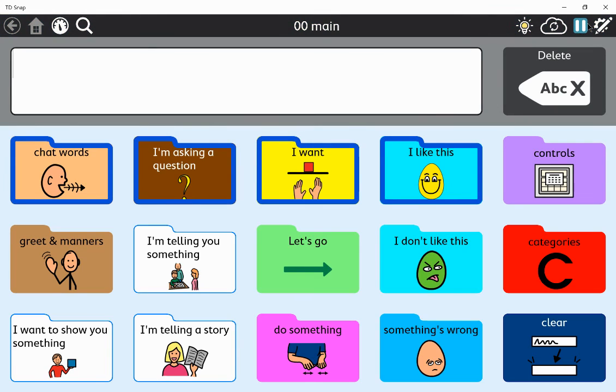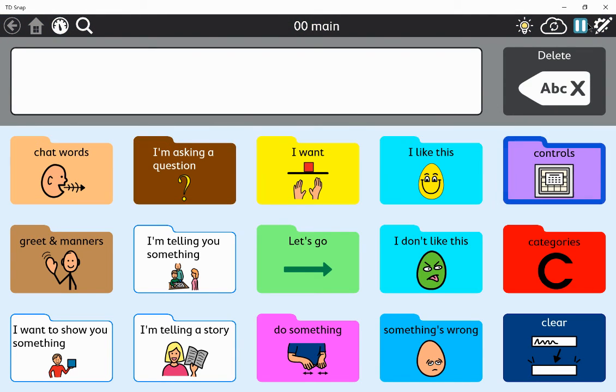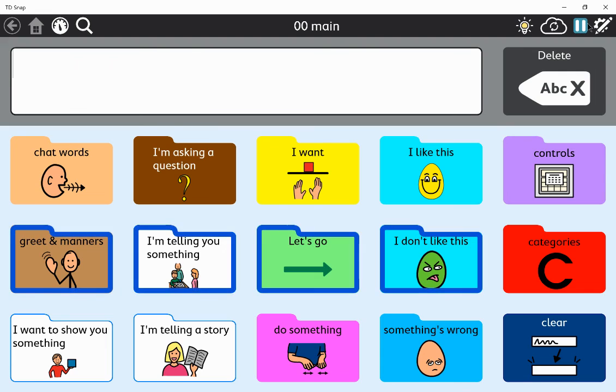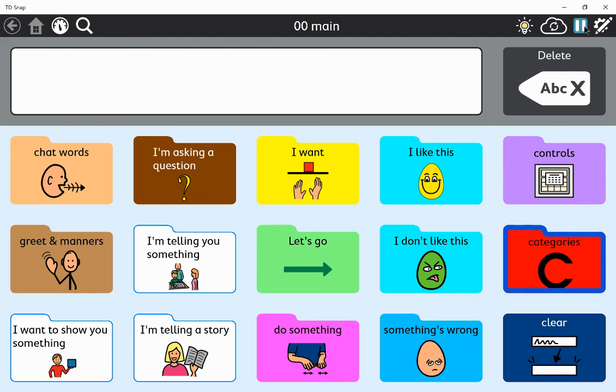Chat words. Question. I want. I like this. Controls. Greet. Telling you something. Let's go. Don't like. Categories. So you can see now that those that I put in a group have a full auditory scan.